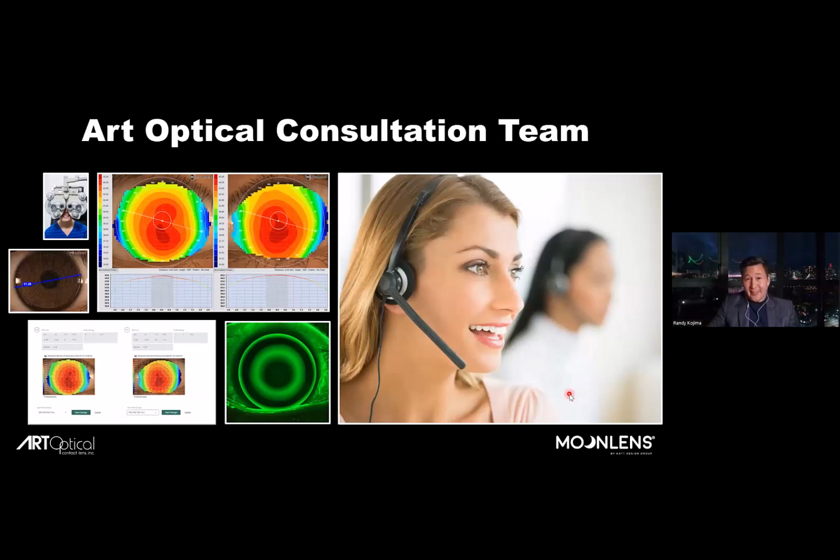And I can't underestimate, and I can't underemphasize how valuable the consultation team is. They are going to be your best friend in this treatment. You cannot do ortho-K without having an expert on your back, having a mentor to help you through this process. Topography might be new to you, and the art team understands virtually every topographer that's out there.